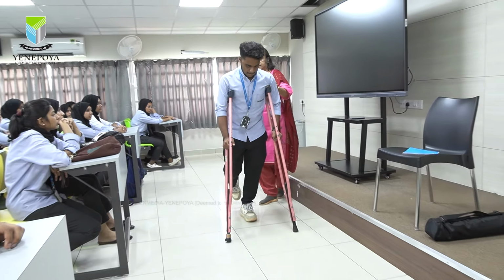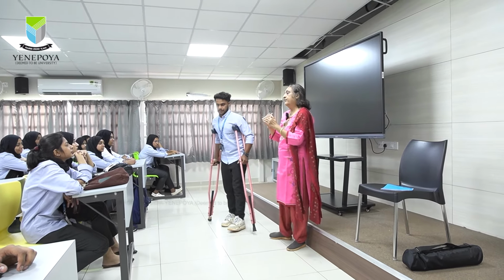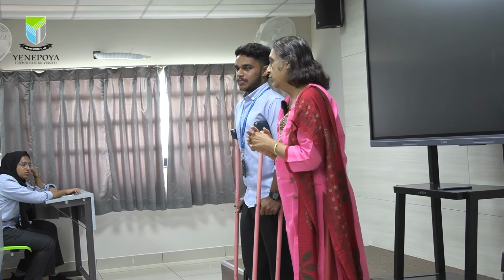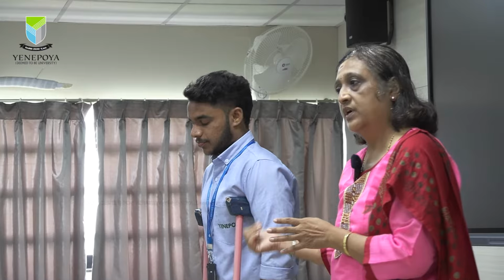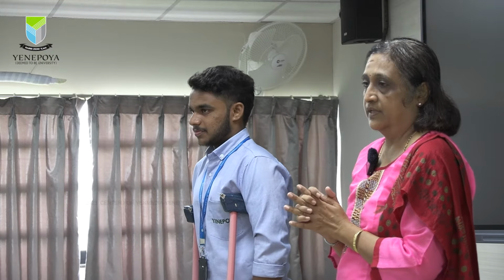Okay. Is it clear? When the leg comes in line with the crutches, it is called a swing 2 gait, and that is what we will train the patient initially before he gets adjusted to the crutches, because for patients with amputation where 1 limb is cut, they have to permanently walk with the crutches, and so they adopt the pattern accordingly.